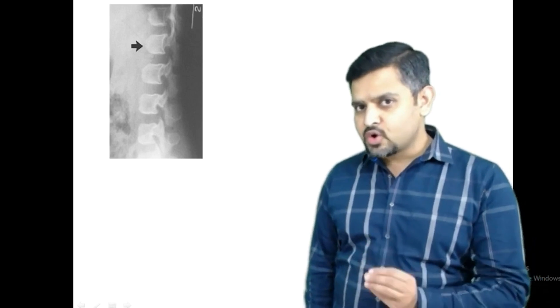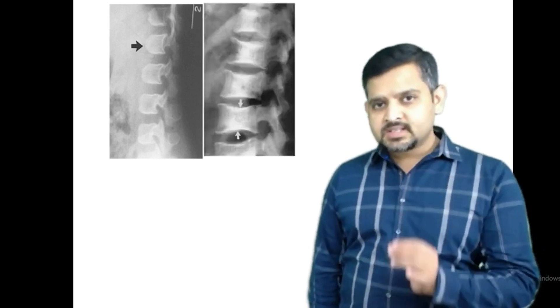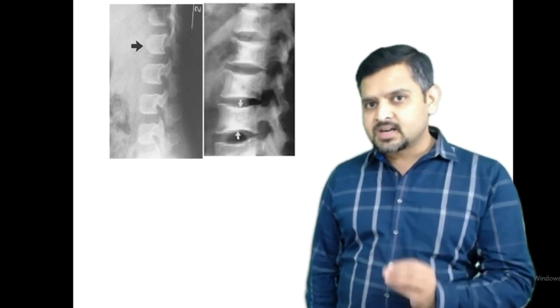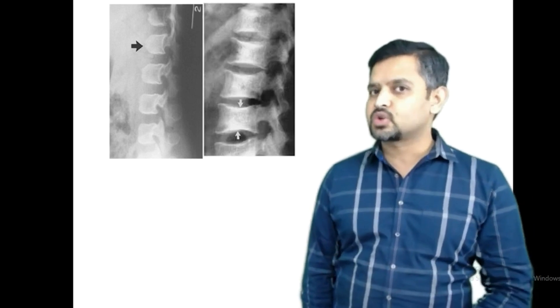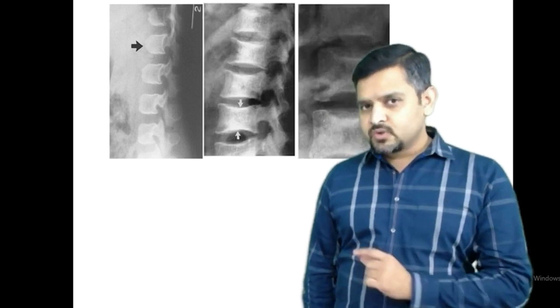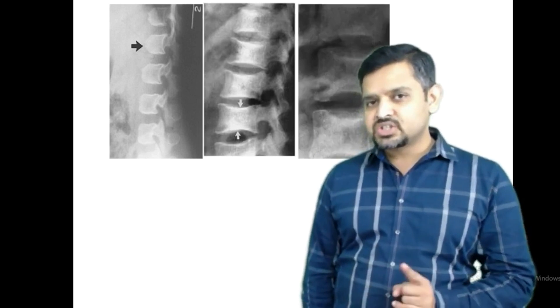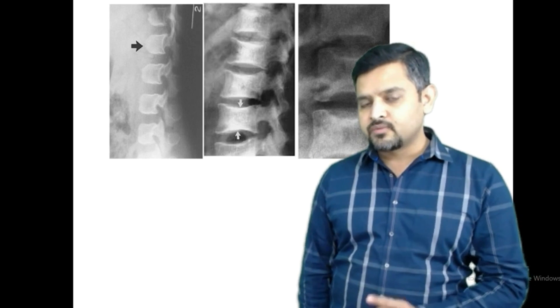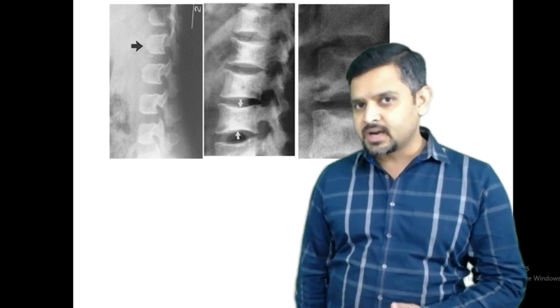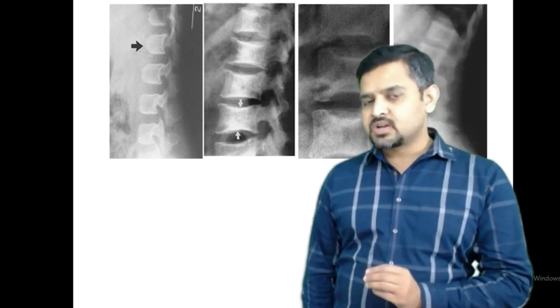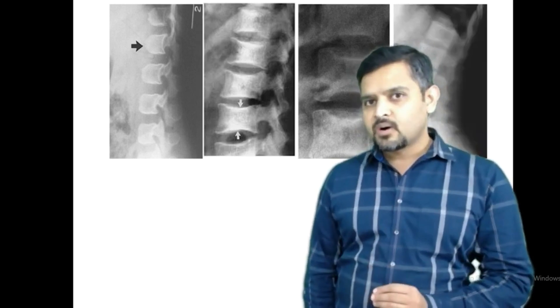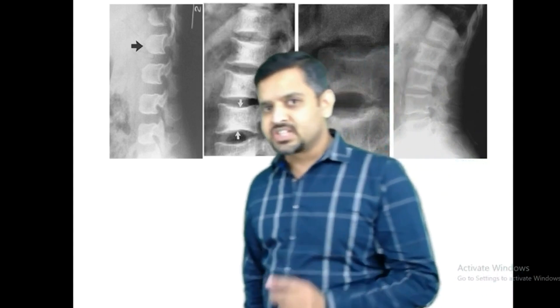This is a typical bullet-shaped vertebra of Achondroplasia. This is a classical fish mouth appearance of severe osteoporosis. This is an H-shaped vertebra of sickle cell anemia, and this is a picture frame vertebra of Paget's disease.